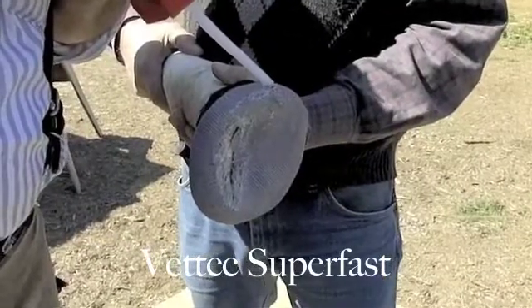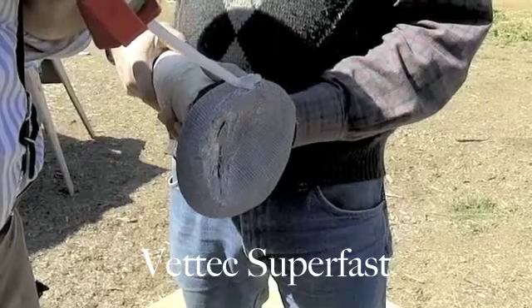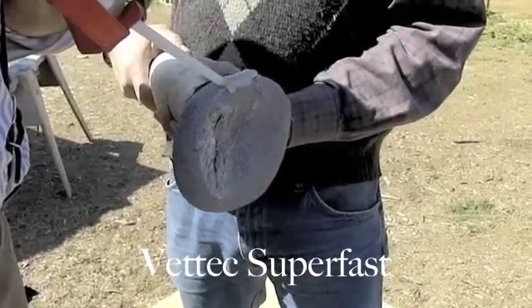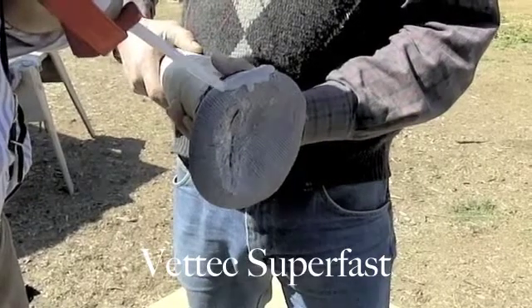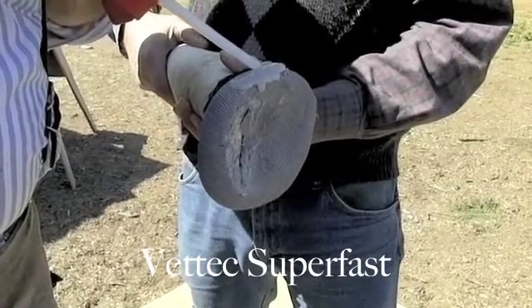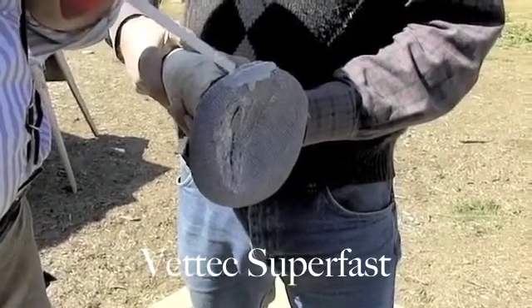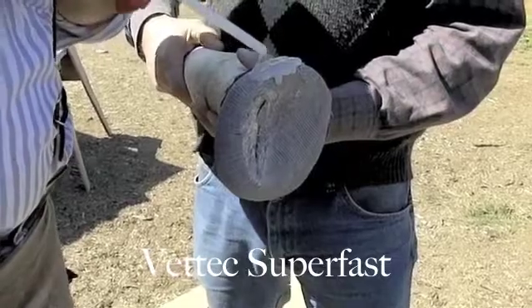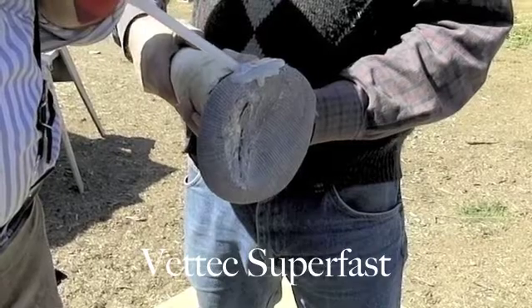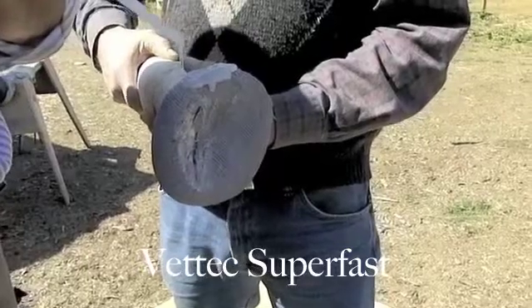When adding a lateral extension, you're going to need more material than you think because you can always remove it later. Apply it steadily and just add it on. The nice thing about doing it this way is you don't have to worry about thermal convection. If you're doing this on a live horse without casting, you've got to be careful not to burn them — you want to lay a series of strips rather than too much per strip.